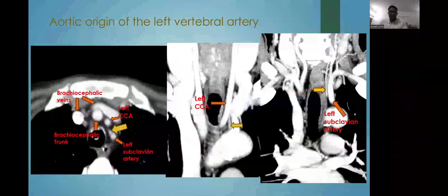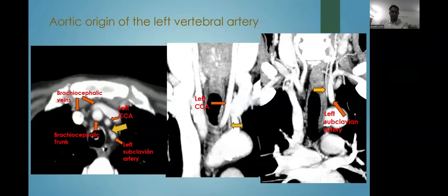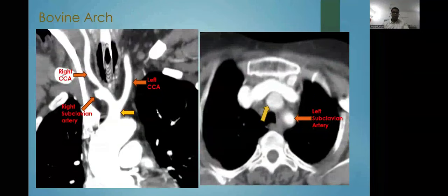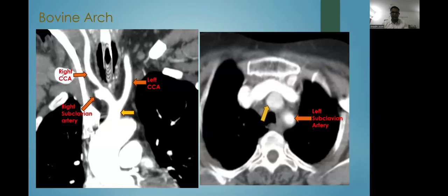The first case is the aortic origin of the left vertebral artery, shown marked in yellow, arising from between the left common carotid artery and the left subclavian artery. The second case is that of bovine arch, in which we see a common origin of the brachiocephalic trunk and the left common carotid artery.